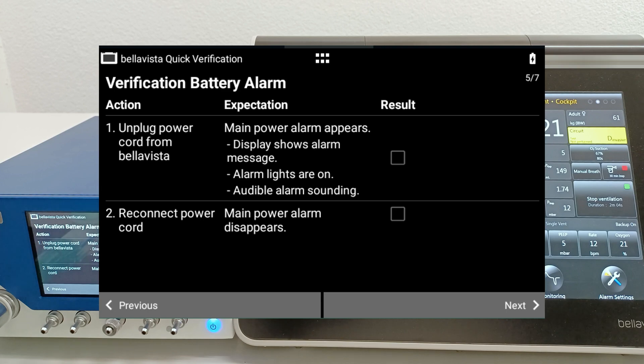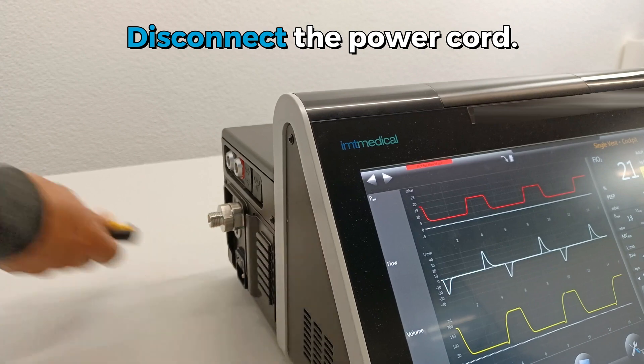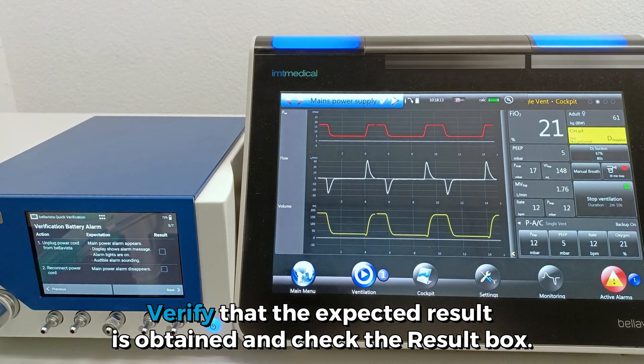Verification Battery Alarm. Perform Action Number 1: disconnect the power cord. Verify the expected result is obtained and check the result box.